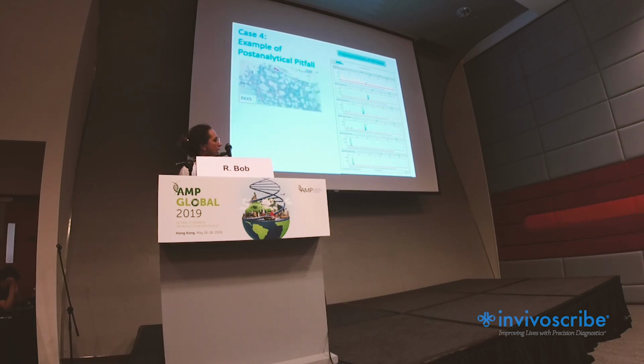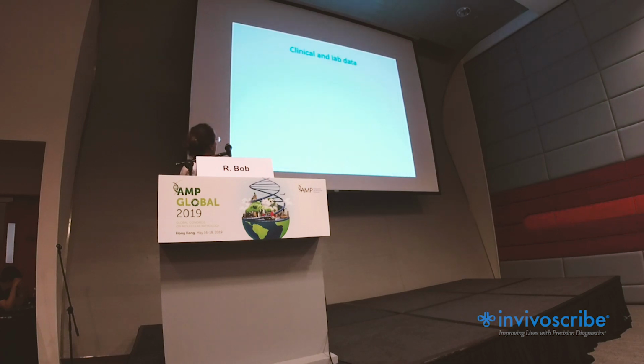Here is the histology. A mild increase in the number of B cells in the bone marrow, really mild, and a little bit more significant increase in the number of plasma cells in the bone marrow, but it's not enough to make the diagnosis of plasmacytoma. So I should now decide, is it a B-cell lymphoma with plasma cellular differentiation? I have done MYD88 mutation analysis, it was negative, and I thought I now need more clinical information about the case.